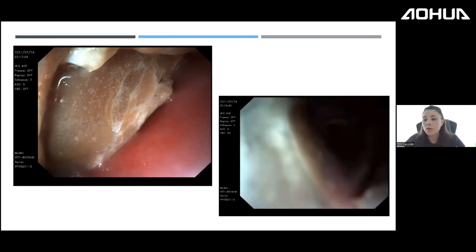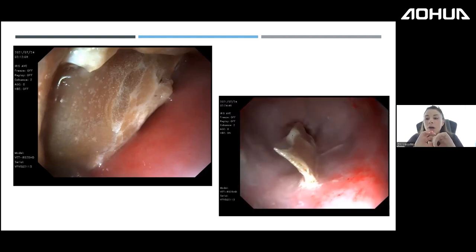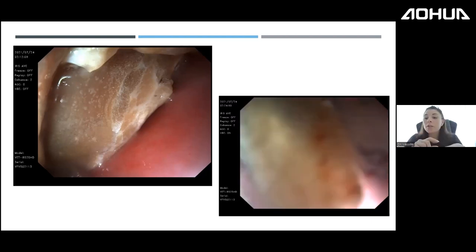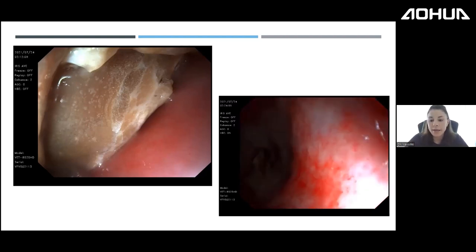After pushing the fragment into the stomach, we wash the esophagus. When esophagitis is severe, I dilute xylokain gel with normal saline and instill it throughout the esophagus to reduce pain.